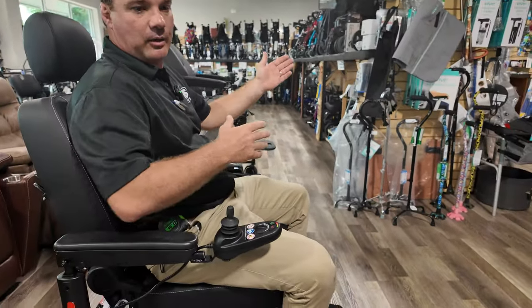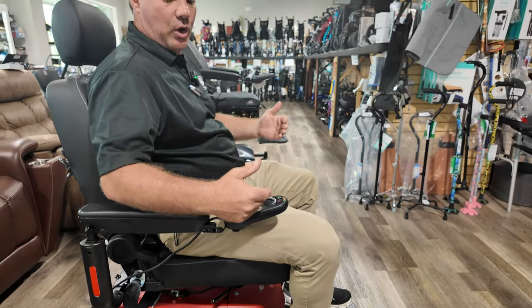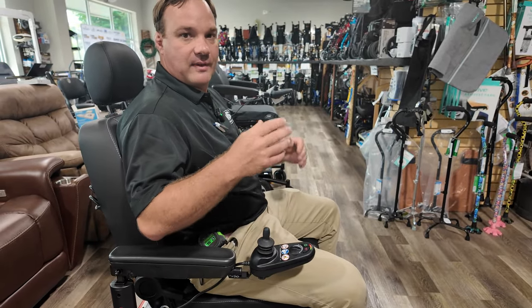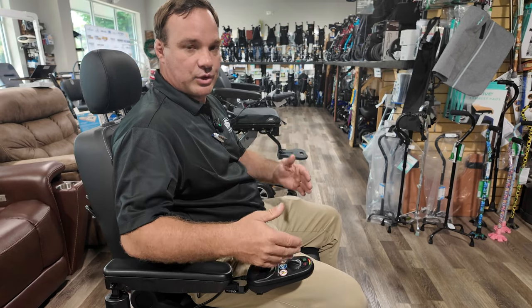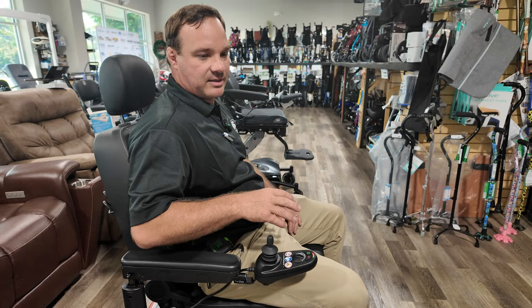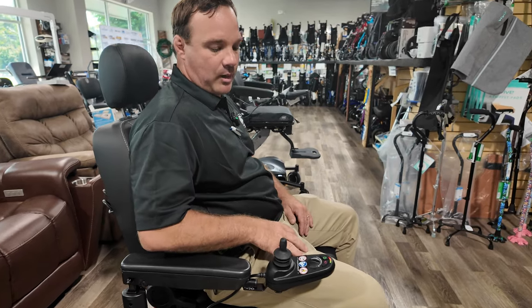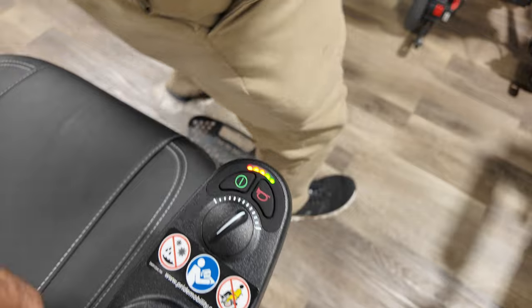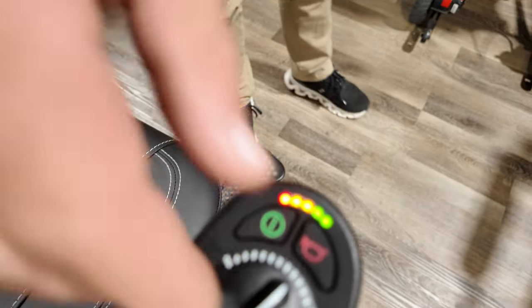If you have two houses and forget the charger, the LI battery will shut itself down and go into a sleep mode. The AGM ones, if they stay plugged up without the charger on, will discharge and could die — you might not be able to charge them back up. There are a lot of pluses to buying the LI power wheelchair or LI battery with this power wheelchair.